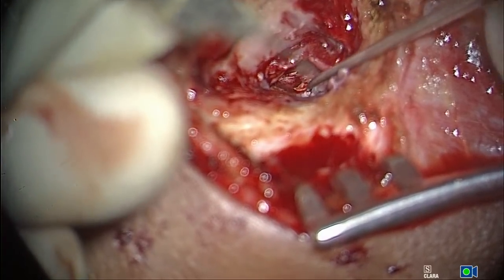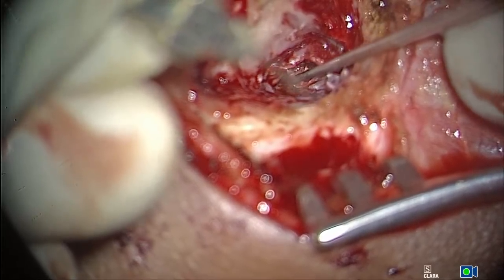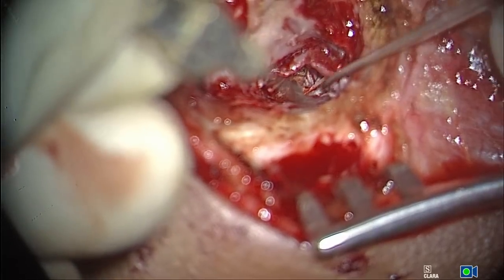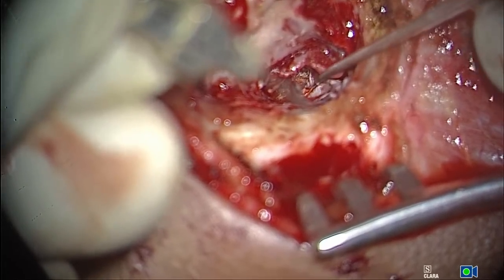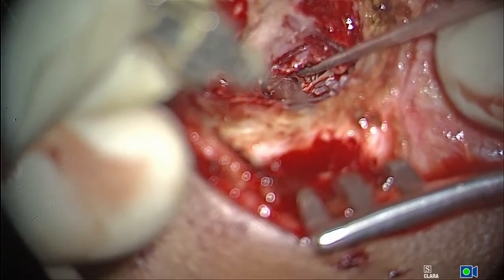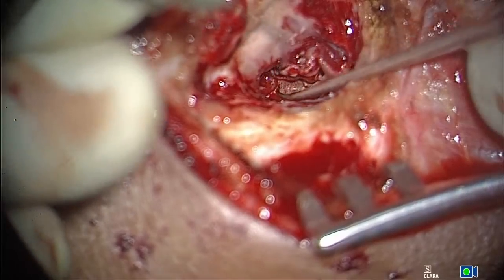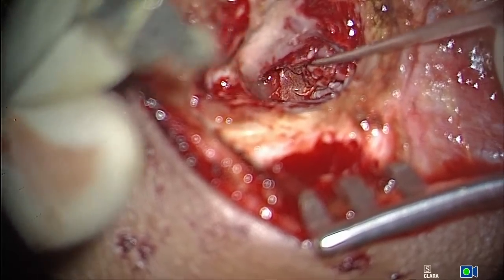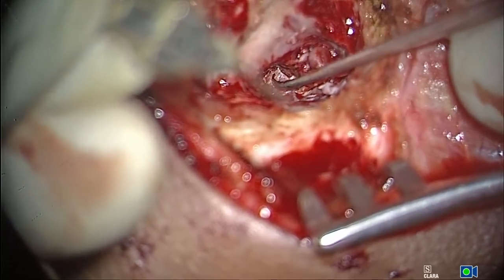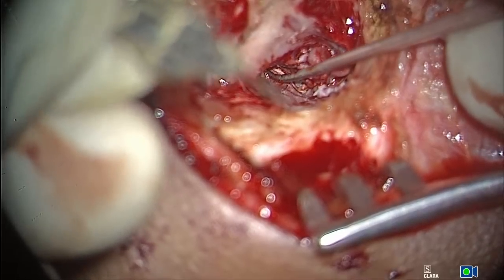I'm going underneath the malleus now. See how the graft goes and sits right there. And now what I'll do is I'll take this. That is the graft. Lift it across.